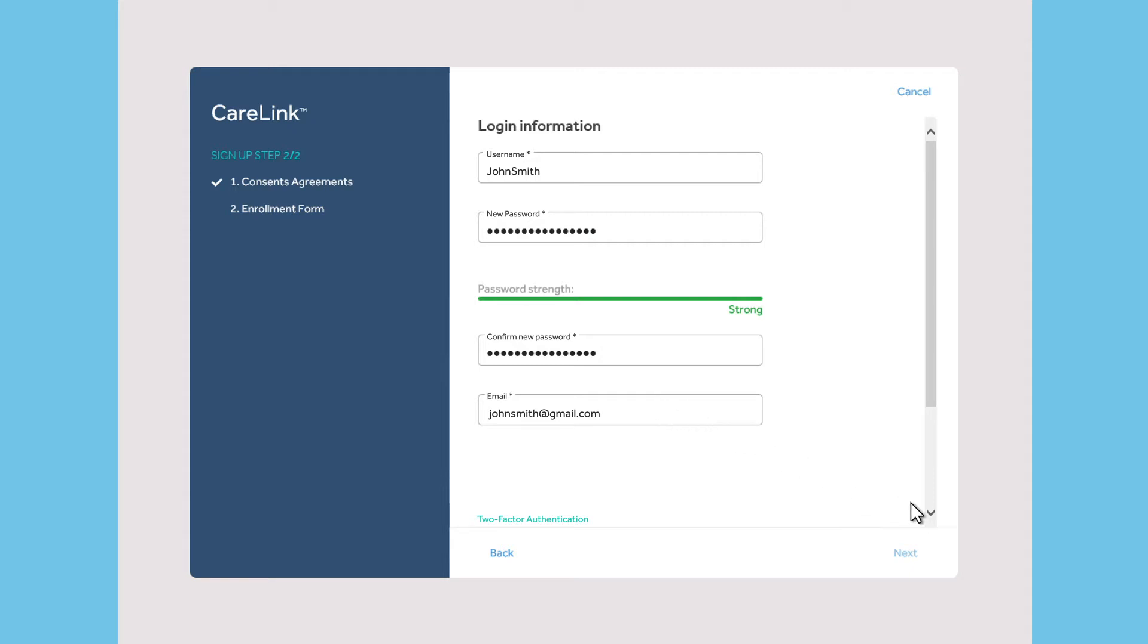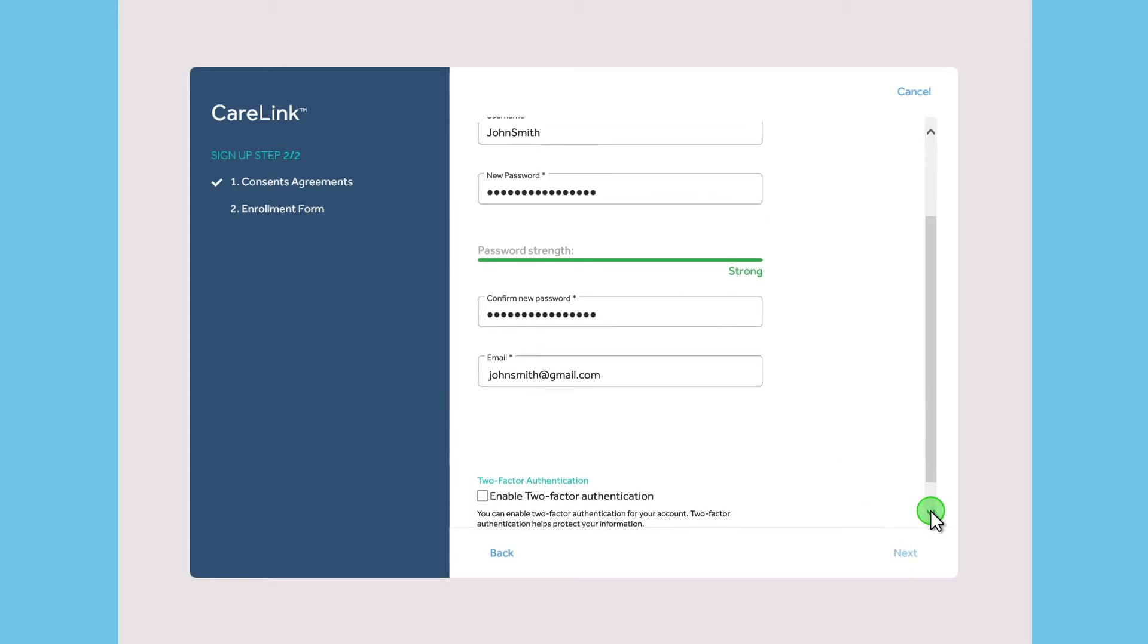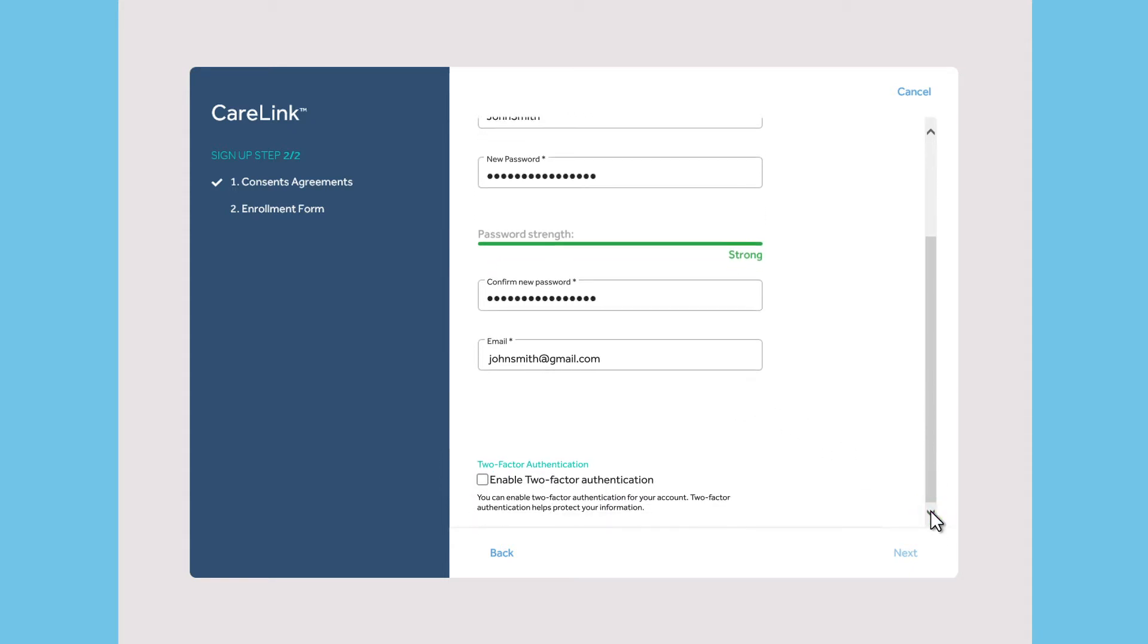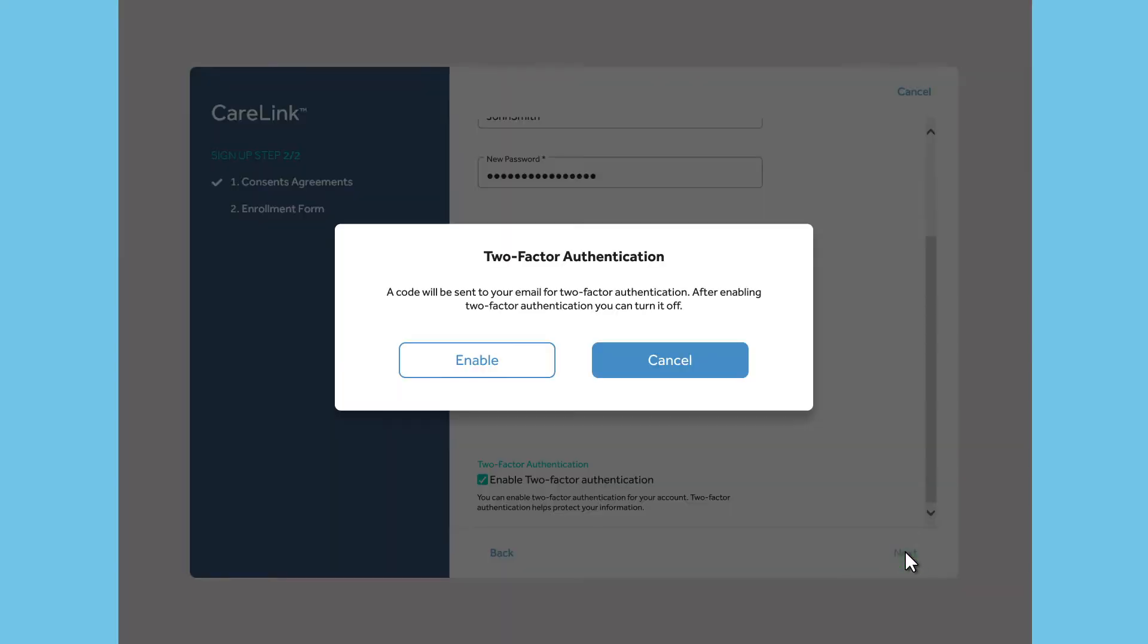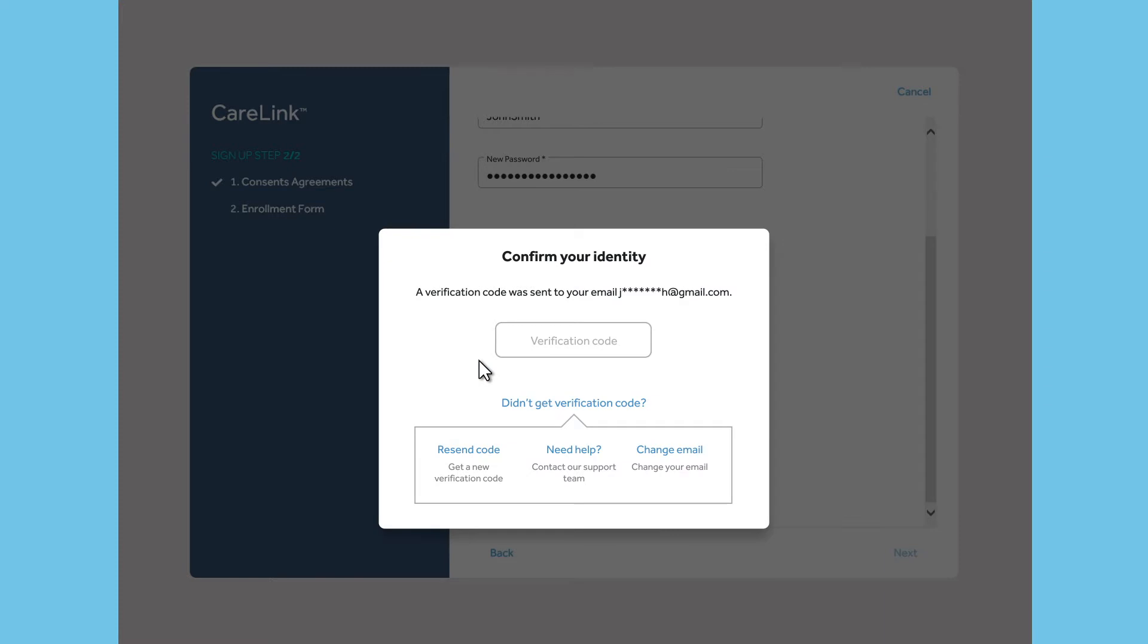Some countries allow for two-factor authentication. If you check the box to enable two-factor authentication, a confirmation code will be sent to the email you provided. You will be asked to enter that code before you complete registration.